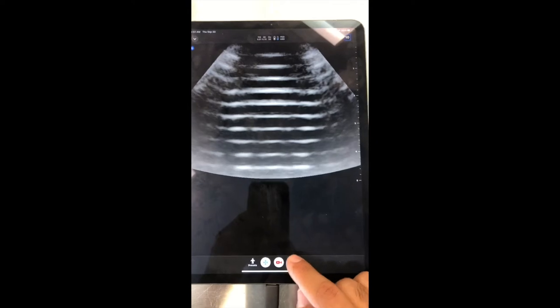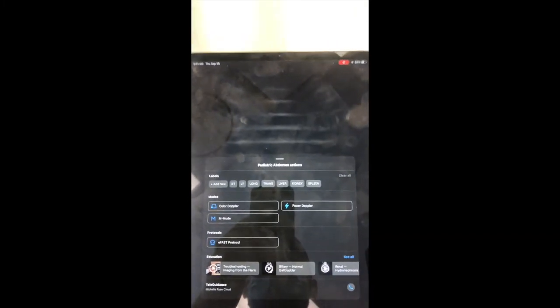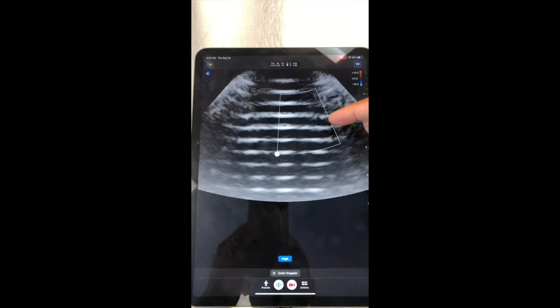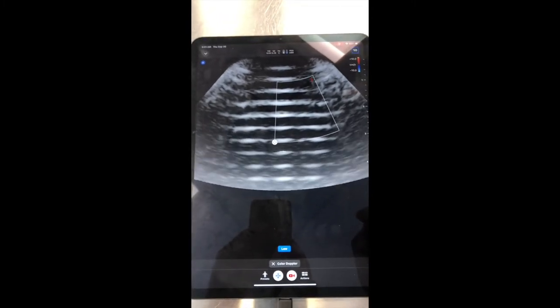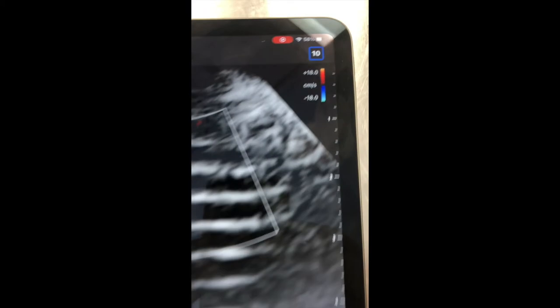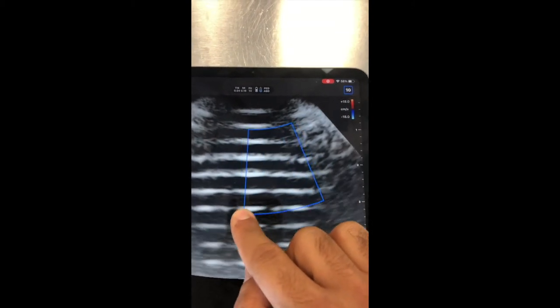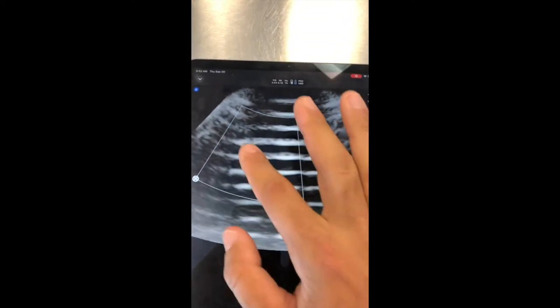The Actions button allows you to access other possibilities for measurements or other types of ultrasound modes. For example, if you are interested in color Doppler, you can place a color Doppler box on a particular structure to see where the blood flow is going. Red is towards the probe and blue is away from the probe. You can select high or low velocity filter depending on the structure. For arterial structures, use a higher velocity filter. By pressing and holding the button, you can change the size of the box and move it over the structure of interest.